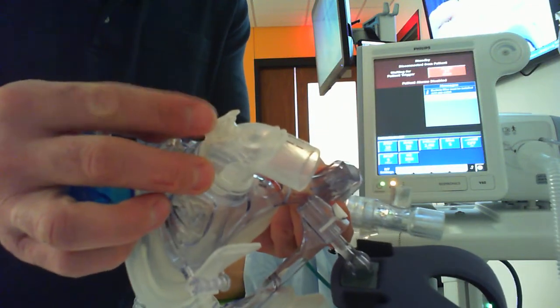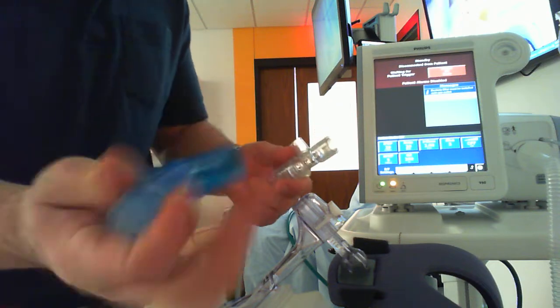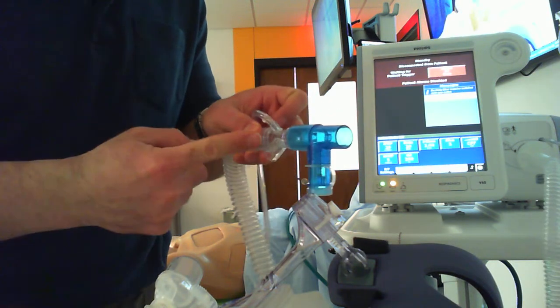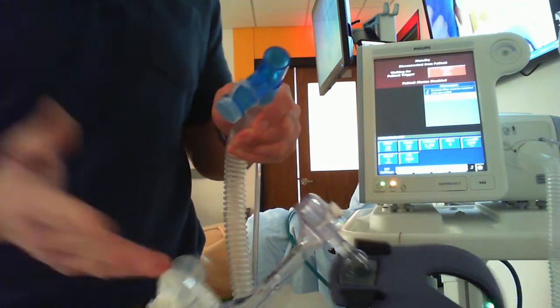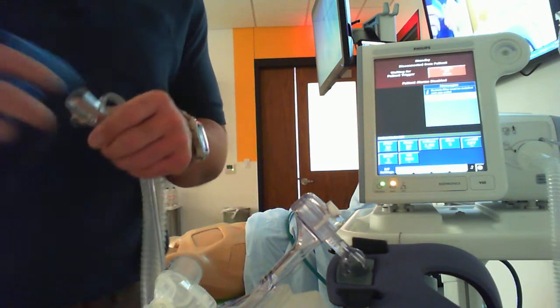Some of these masks actually do have a little spot in the top of the mask where, if you have the proper adapter, you can put an Aerogen right into the top of that. You could also use a valve T-piece, okay, but that connection needs to be past this, so distal to the exhalation port and proximal to the patient's mask. It does add on dead space, so if you're having problems or concerns about that, you don't necessarily have to leave it in line all the time, but it's important to know where to optimally place that.